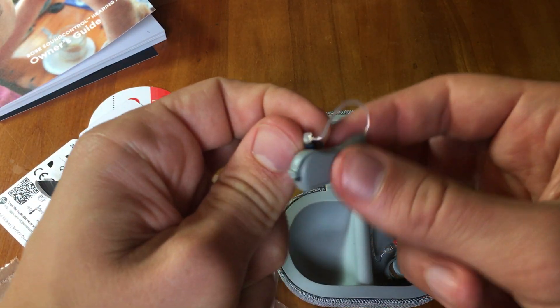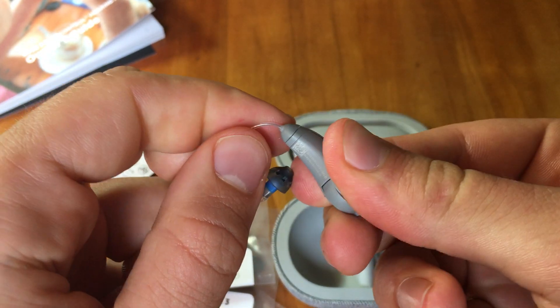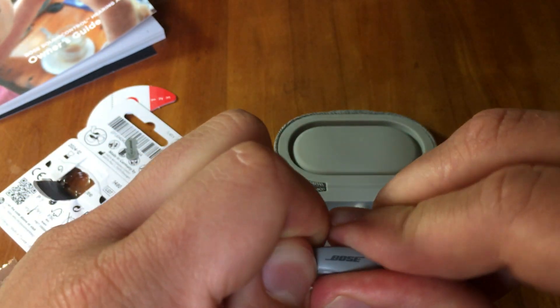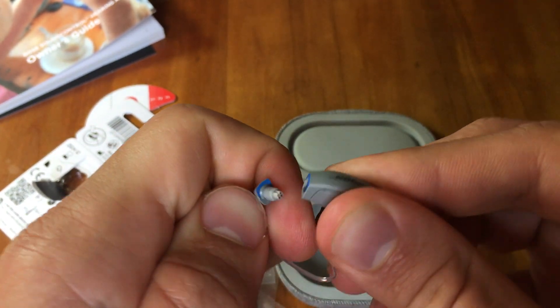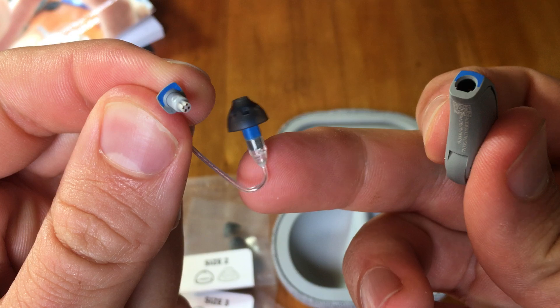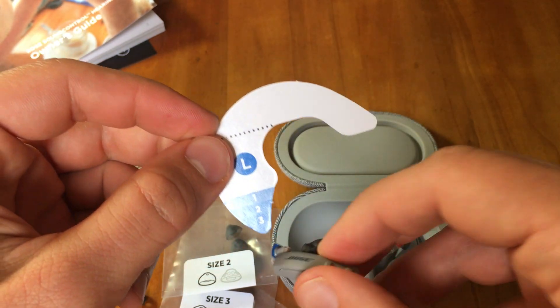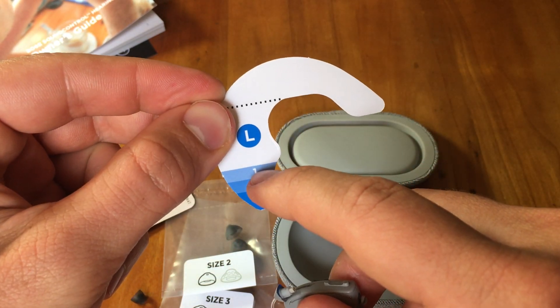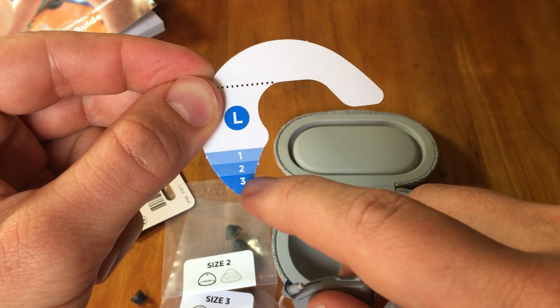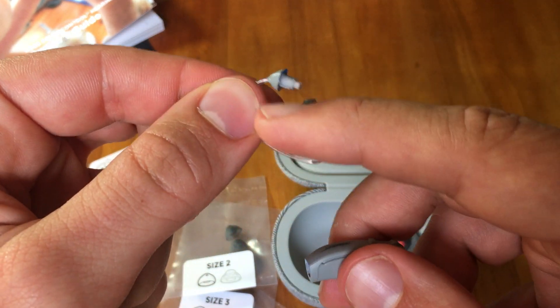If you are asked by Bose to change the receiver wire — which is the piece at the top of your ear — you pop it off carefully without removing it completely from the device. This is a length 2. You hold it up to your ear, with this part going over the ear, and wherever the top of the opening of your ear canal lines up — whether that's number 1, 2, or 3 — that is where you size the appropriate length for the receiver wire.